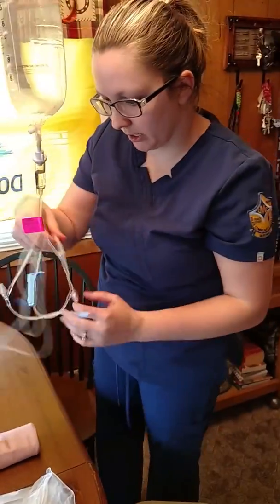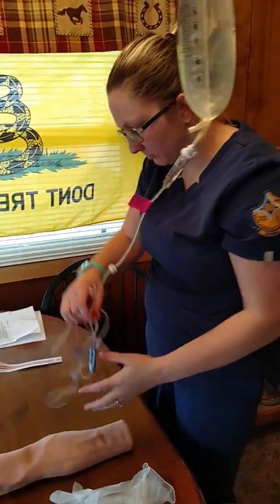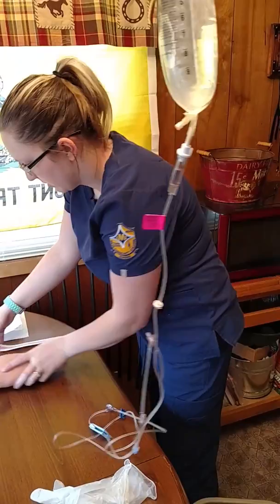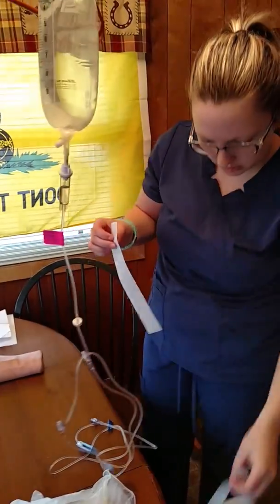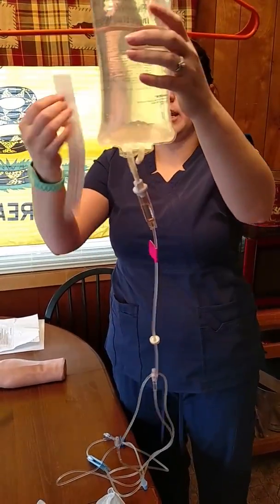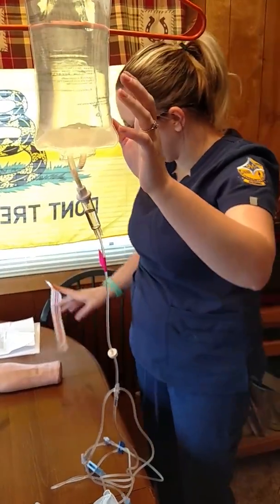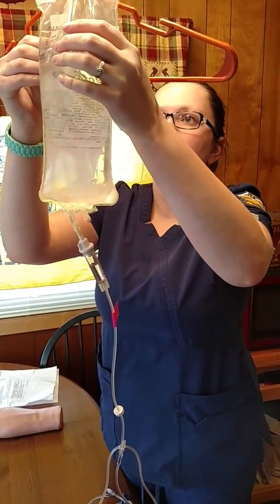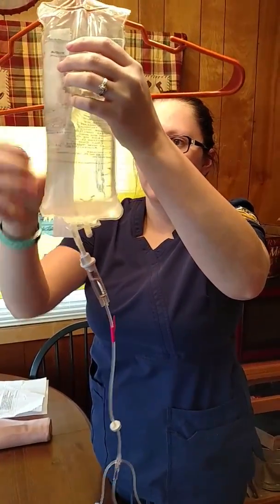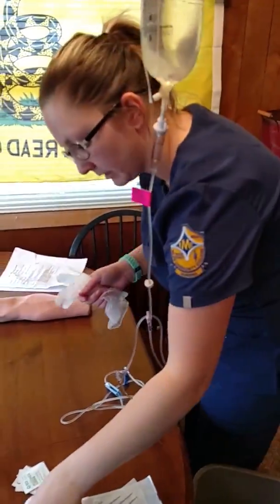Okay, so this is all ready here. Now I'm just going to grab my stuff and go start the IV. Oh, before that I would actually label my bag here, and this just has the drops per minute and then how many hours I'm hanging it for, which is 6 hours. So I've got that all calculated out here. We'll just line that up with where the fluids start.